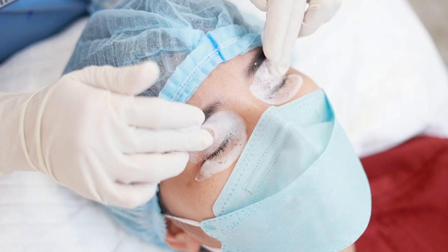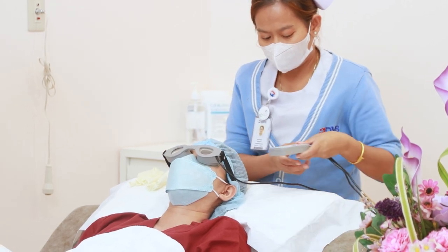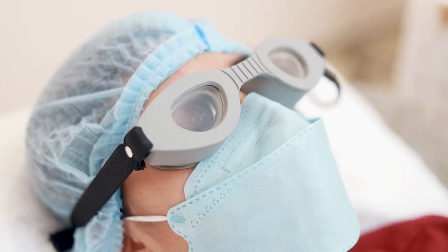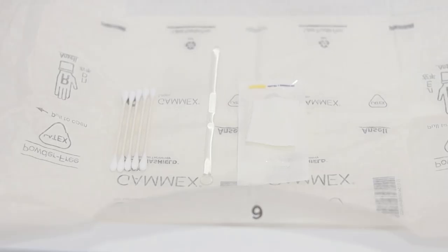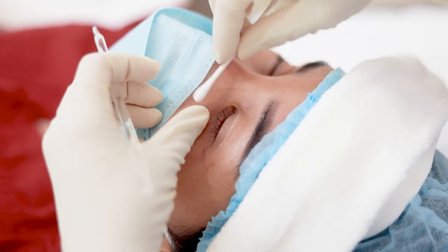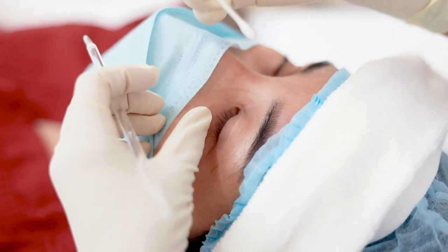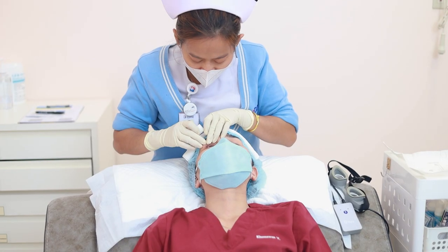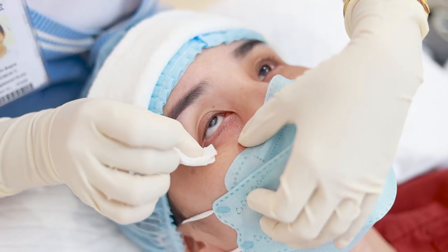The eyelid treatment or eyelid spa uses the same technique to provide heat and release the blocking inside the meibomian gland. We start with a good clean to the eyelid, then provide warm compression using a buffer steam machine that delivers heat and moisture. Our trained nurse then uses a cotton tip to clean and release the blocking inside the meibomian gland.